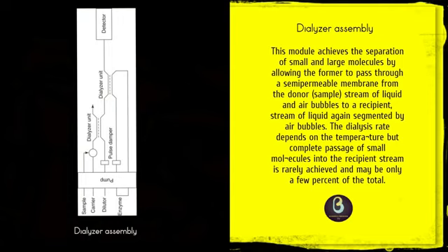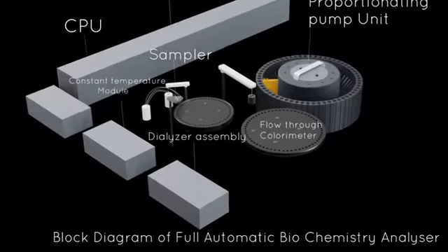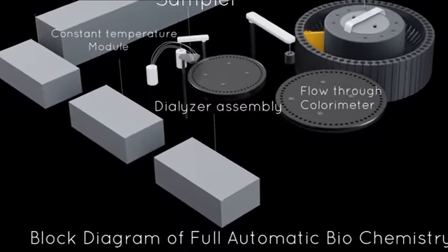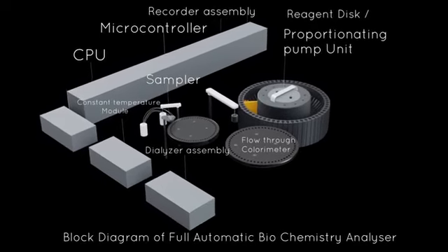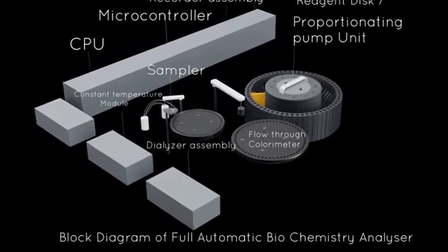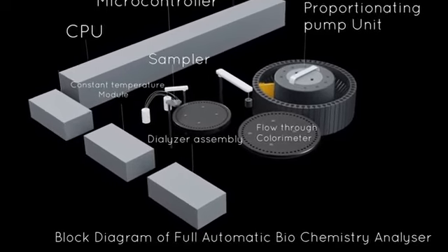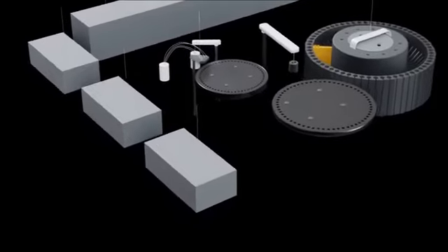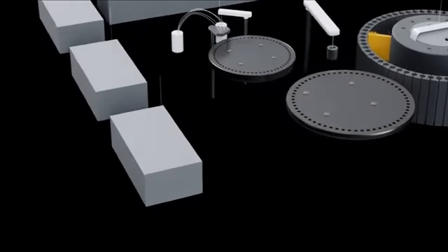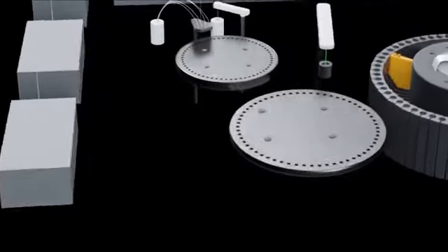The analytical process then requires that a constant fraction should dialyze, and this is not always the case when simple aqueous and protein-containing solutions are compared. It is important to ensure that the two streams flow in the same direction. Care must be taken to ensure that the output from the recipient stream is one which enters the remainder of the analytical system. If the sample stream is greatly diluted, the difference may not be seen easily.